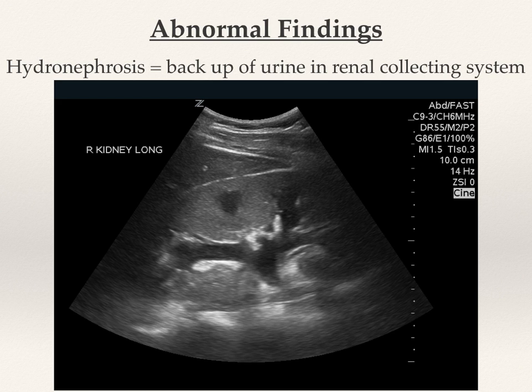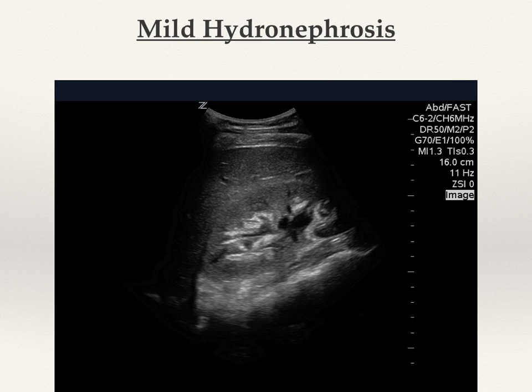So with the right symptoms, maybe they have blood in their urine as well. 63, with a history of renal colic, we might be more suspicious. What else could this be, though? What else looks anechoic? So cyst could, and we'll talk about cysts. The other one to think of would be blood. Is this that we've just caught the renal vasculature at an angle? Okay, so that's there within the renal sinus.